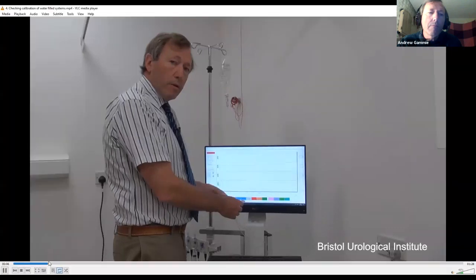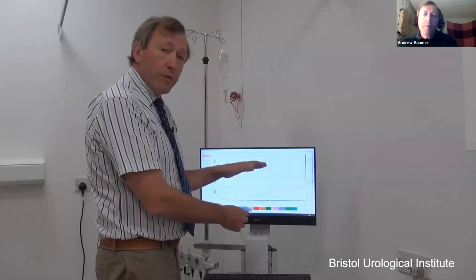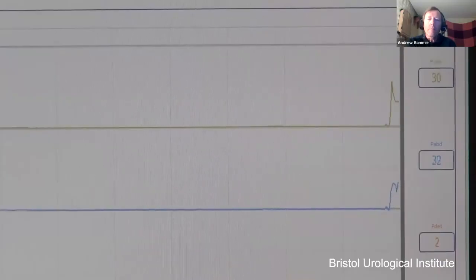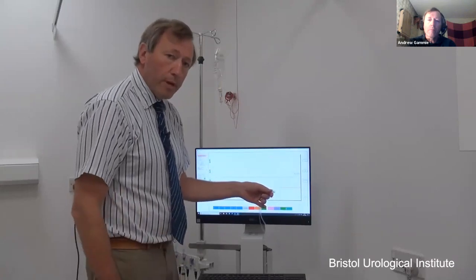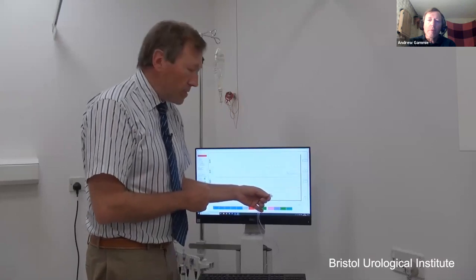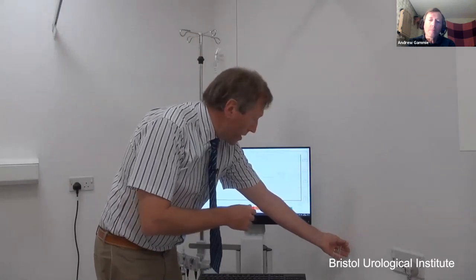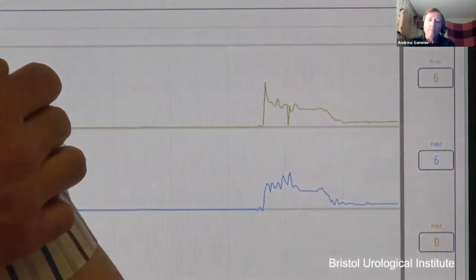Now we've got the pressure set to zero, and my PVES and PABD are reading atmosphere pressure as zero, I can open up the taps to the patient and see that I am indeed picking up pressure as I raise and lower these water-filled tubes. I can use these tubes to check the calibration of my water-filled system. I've got a marker on the wall here that is at the 0 centimeters mark, and I'm just noting the pressure at these points. It says 6 centimeters of water on both channels.